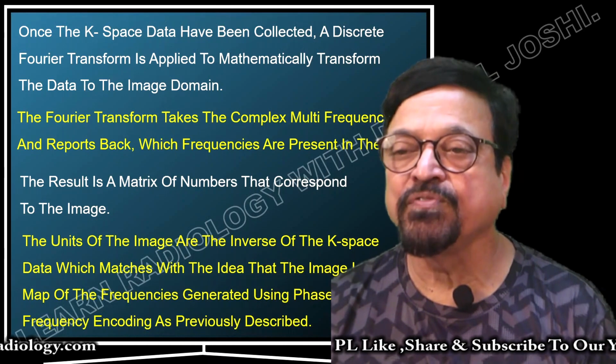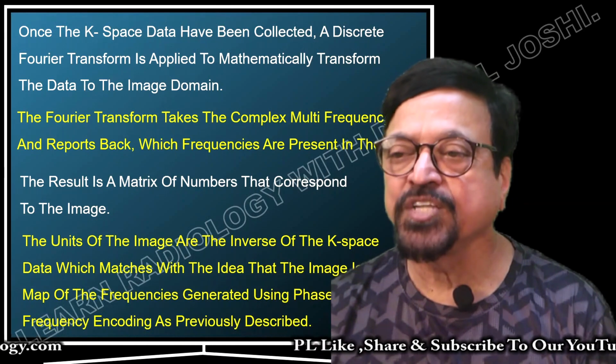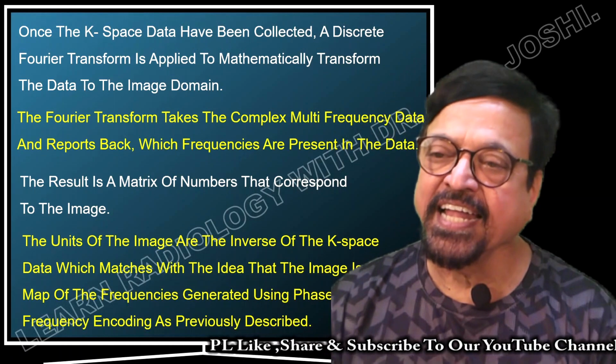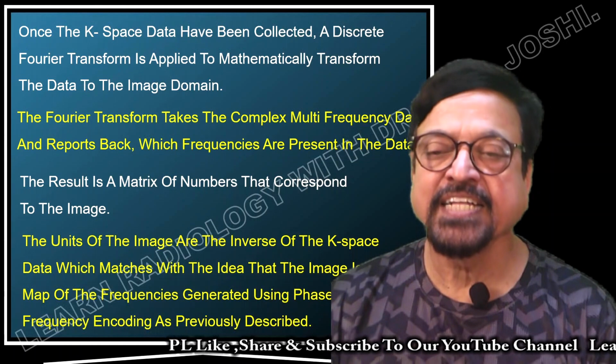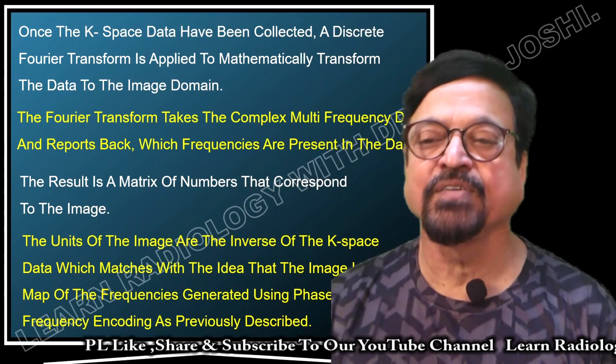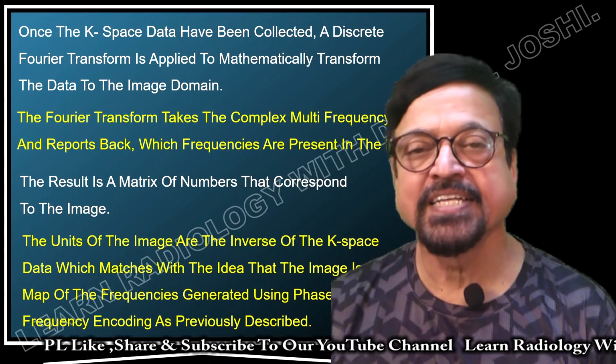The unit of the image is the inverse of the k-space data, which matches the idea that the image is a map of frequencies generated using phase and frequency encoding as previously described.